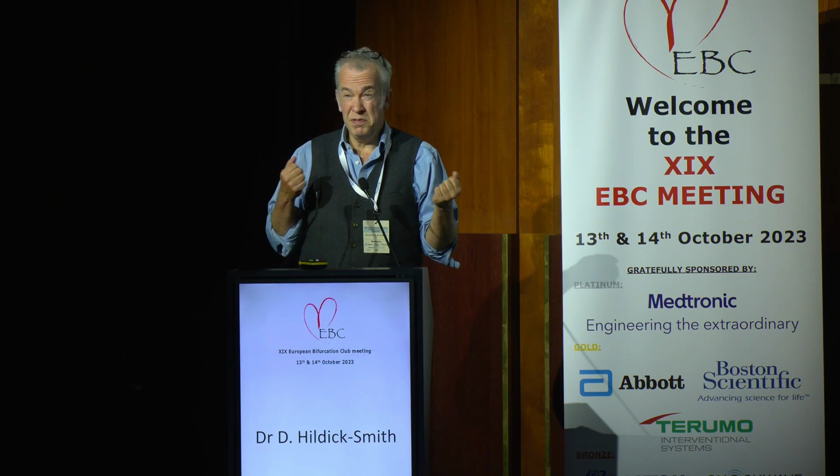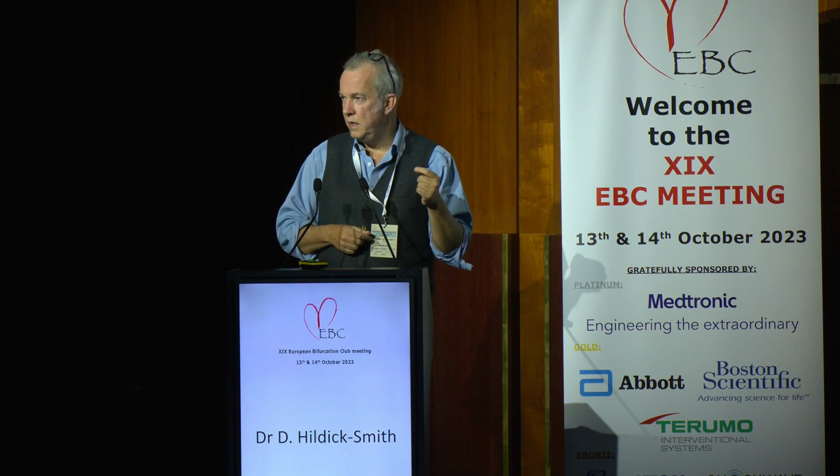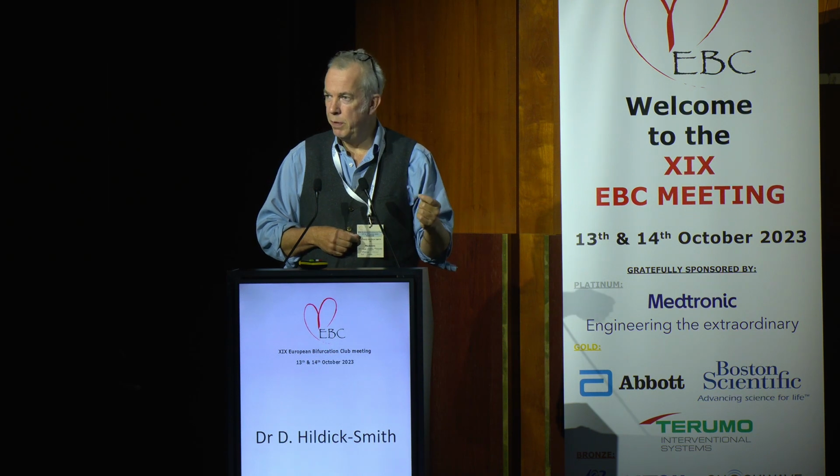We have to sometimes say, well, you're going to have to stop some medicine and take a risk. Again, that could be something that we don't have to face, at least nearly quite so much, with balloon therapies which don't leave a permanent implant.